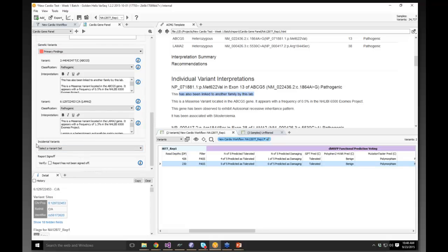In fact, everything about this layout is defined by what I mentioned is the template programmatic engine, which is basically a JavaScript file. So if you are comfortable in that land of building custom web app type stuff yourself, feel free to use our documentation and do that. Otherwise, if you want to change the structure significantly, we provide a service to do that for you, and we can bundle that in when you get your setup of VarSeq and go through that as an iterative process.